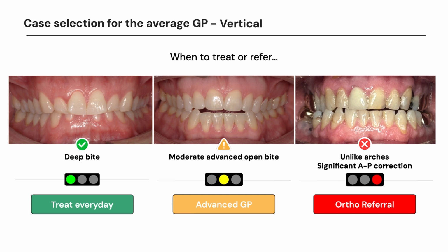What about this next one? Well, that's an open bite, and I see about 3 millimeters of gap there. That means I'm going to want to get that closed, say 4. Well, that's just inside my range there. I think I could do that, but that's more advanced.